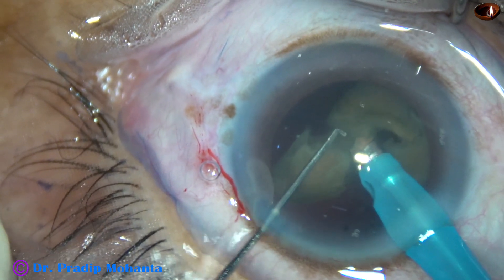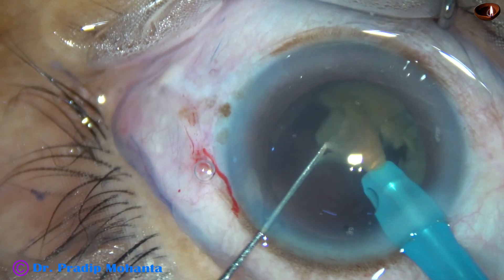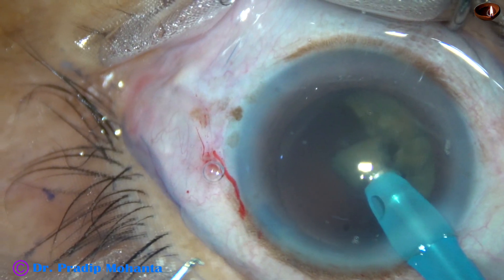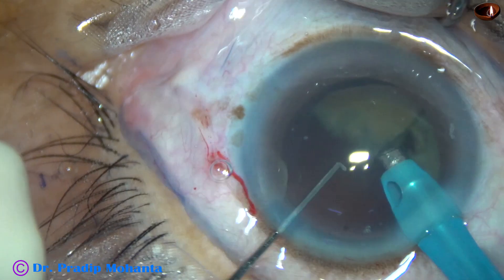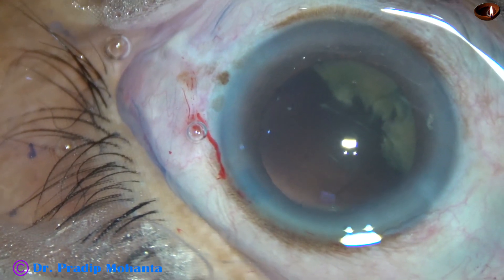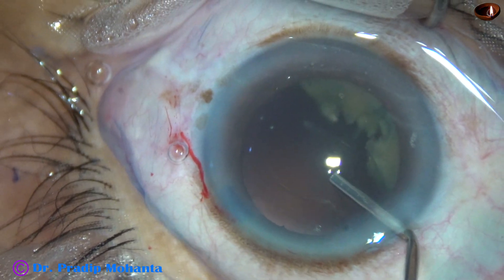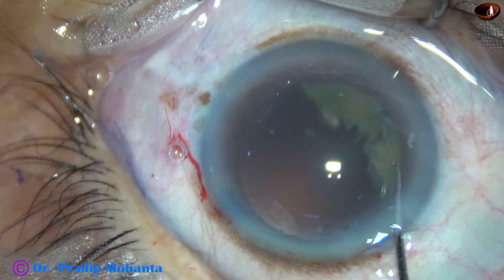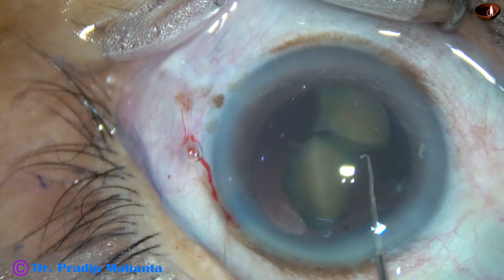All nuclear pieces have been emulsified. I find that the last piece is not coming, so I come out. I fill the capsular bag with viscoelastic. And now I am going to use two Sinsky hooks to bring the pieces to the central part.